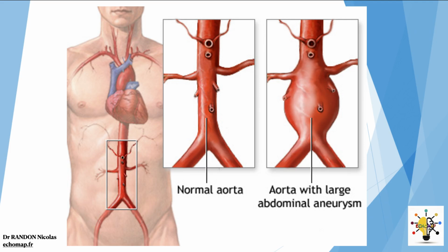The first wall change we'll observe is the aneurysm. Aneurysms, you're going to be confronted with them very often. It's by no means something rare. Our patients are getting older and older. Our patients have cardiovascular pathologies. Our patients smoke. And so aneurysms, particularly in the aorta, you're bound to spot them in your career. You're going to spot a lot of them and tell yourself that the diagnosed ones are going to do your patients a huge service.